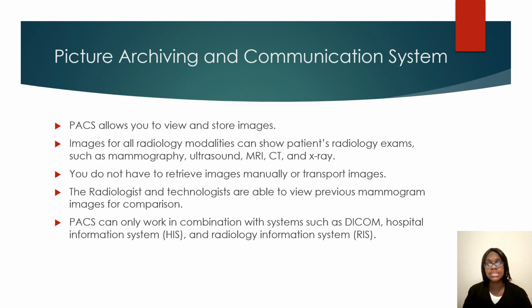For your PACS, this is what you're going to use to view and store images. This is very helpful, especially in a lot of radiology modalities where you can see previous mammogram, ultrasound, MRI, CT, and X-ray exams. If a patient comes in the next year, you can see the images from the prior year. You do not have to retrieve images manually or transport images. So the radiologists and us technologists can use PACS to view and compare previous images.